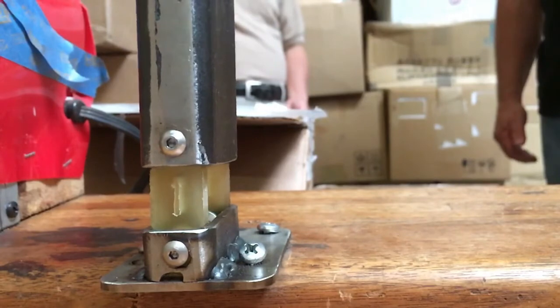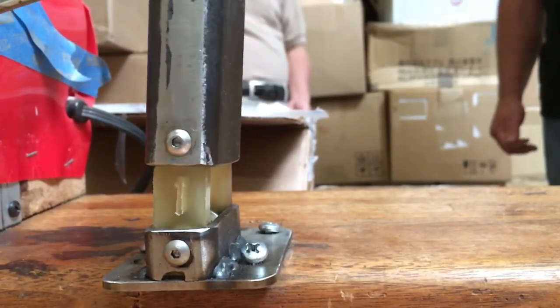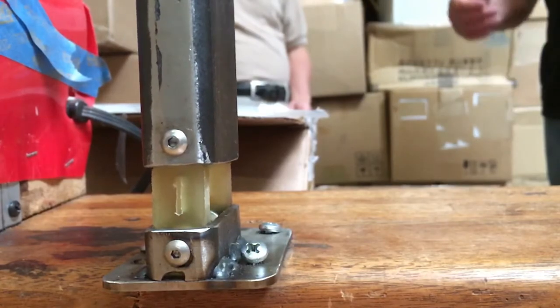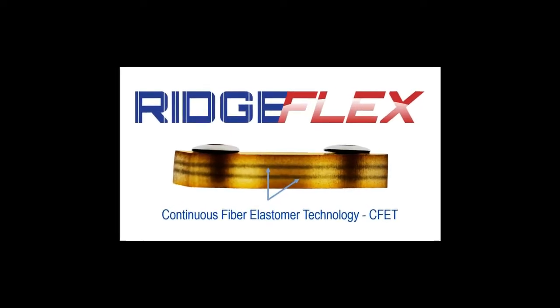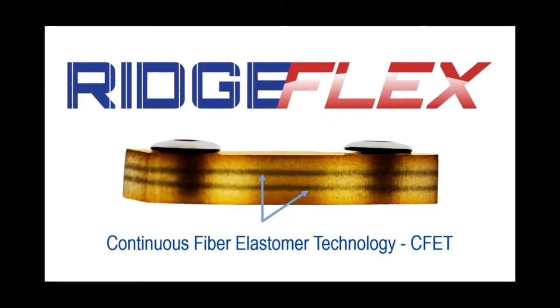The Ridgeflex Ankle Joint represents optimal balance between flexibility and rigidity. This optimal balance is due to the utilization of our new proprietary continuous fiber and elastomer technology, CFET, called Prepalon.